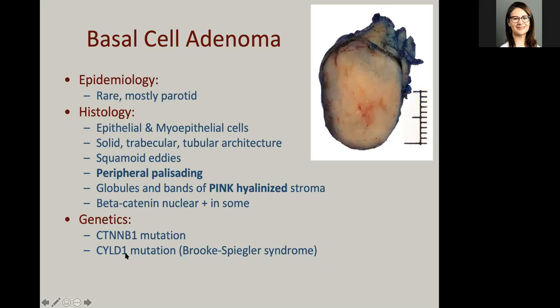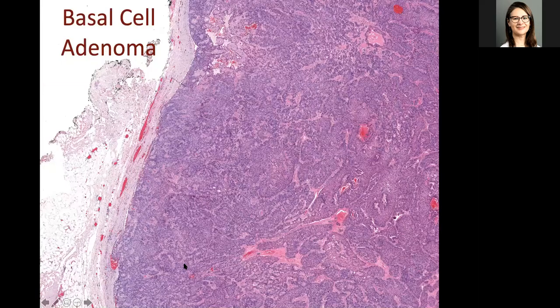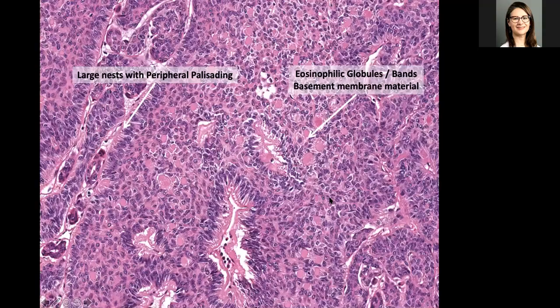So I'll show you a picture of the familial dermal cylindroma or the turban tumor. But these basal cell adenomas can resemble those tumors histologically as well. So what do they look like? Again, the benign ones are going to have a well-circumscribed border, and they are very blue and very cellular. So remember that when you have an FNA diagnosis of a basaloid, or blue salivary gland neoplasm, basal cell tumors are on that differential diagnosis as well.